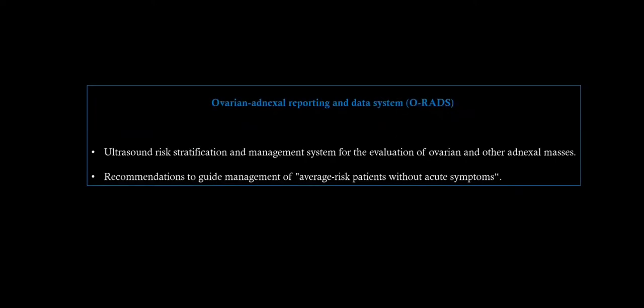So basically, O-RADS provides us with an ultrasound risk stratification and management system for the evaluation of ovarian and other adnexal masses. It also provides a recommendation to guide the management in these patients. The patient selection criteria is average risk patients without any acute symptoms.